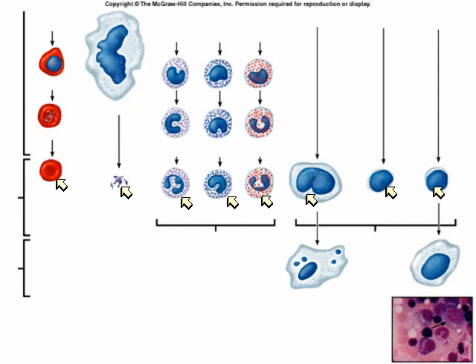So if you were suffering from some disease and the lab performed what's called a differential white blood cell count, they're going to look at slides made from your blood and literally count the white blood cells. They'll try to count at least 100 and do a percentage, figure out how many of those are neutrophils, how many are basophils, how many are eosinophils. Once they figure out the number of each, then they can determine the percentage, and if the percentages are not within the normal values, they can better determine what type of infection you're trying to fight.